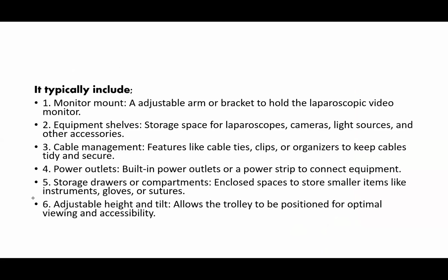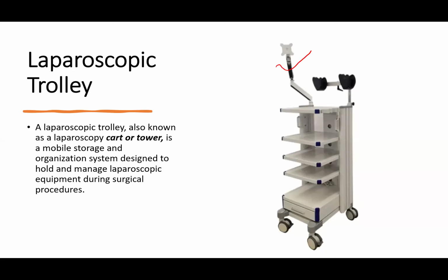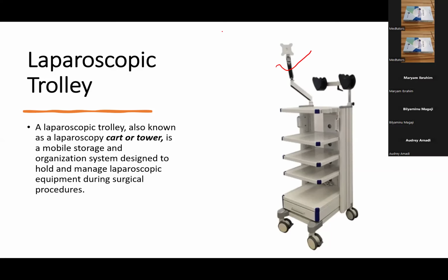The monitor mount is an adjustable arm or bracket to hold the laparoscopic video monitor. On this previous image, you can see the monitor mount. It is mounted in such a way that the screen is well displayed.